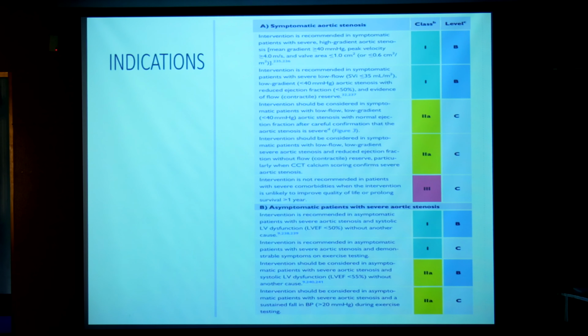We're discussing indications, investigations which help the surgeon for a safe aortic valve replacement, and some complications along with operative steps. Coming to the bibliography, Kirklin has given excellent operative instructions for aortic valve. These 4 books need to be read.